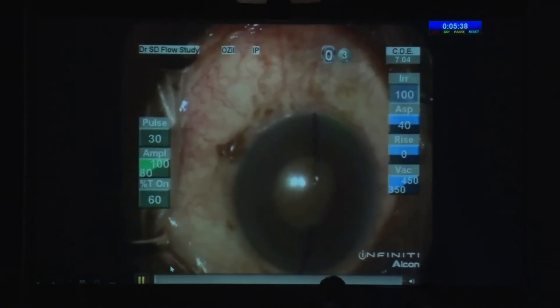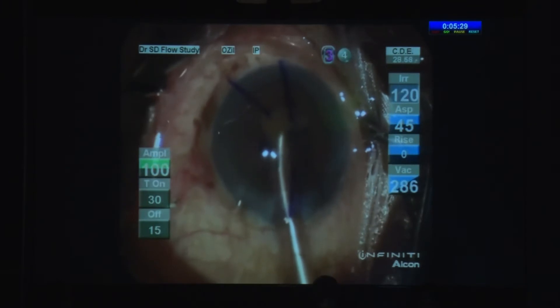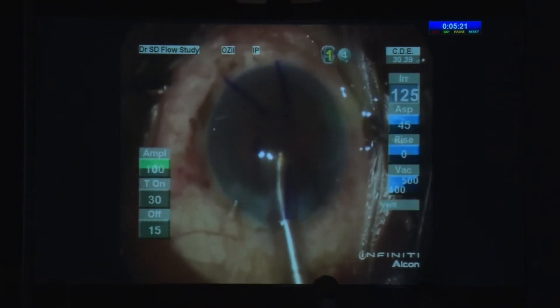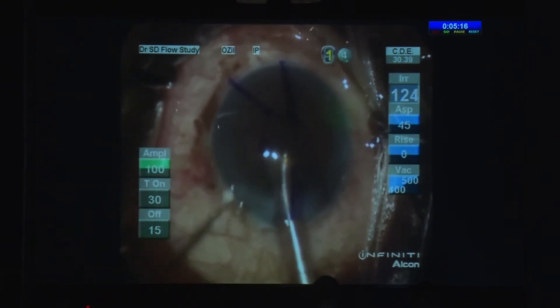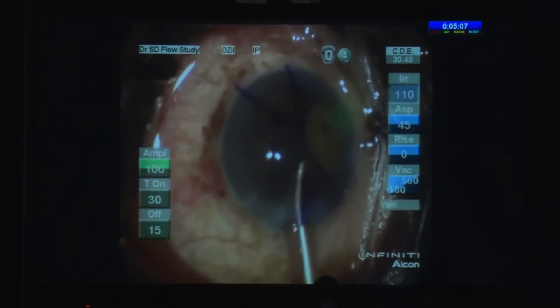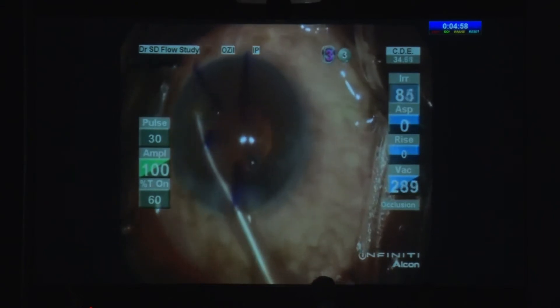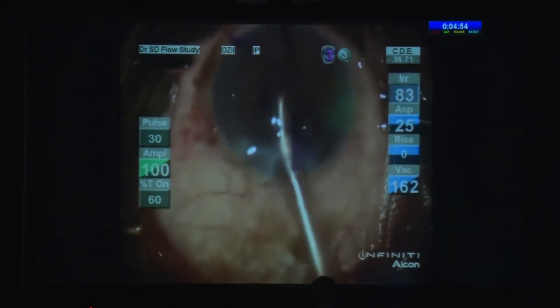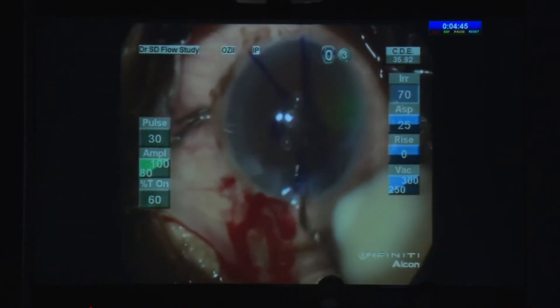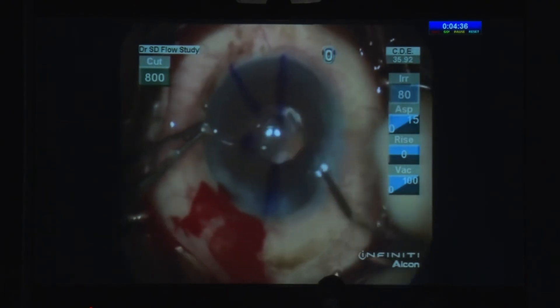This was a Morgagnian cataract. As you can see, there's enthusiastic marking on the cornea. The thing with Morgagnian cataracts is it's a small nucleus, but the capsule is very, very motile — very mobile, so it really comes forward. I got the capsule. I had Viscoat in hand and injected it behind the nucleus. The nucleus was in position, so I just moved it to where I could emulsify it easily. The important lesson: do not remove your handpiece or stop irrigation suddenly — otherwise you can't implant premium IOLs because they won't go into the bag anymore.